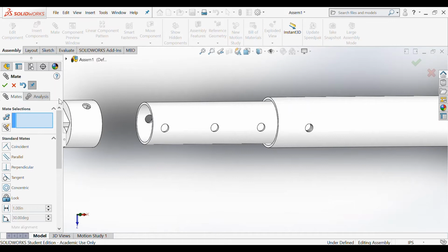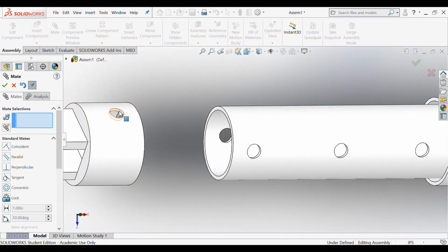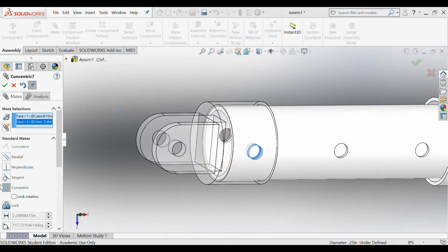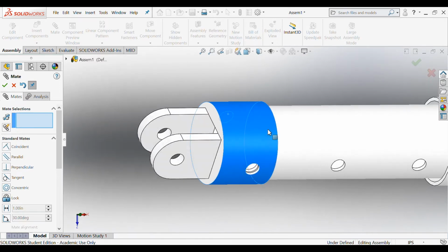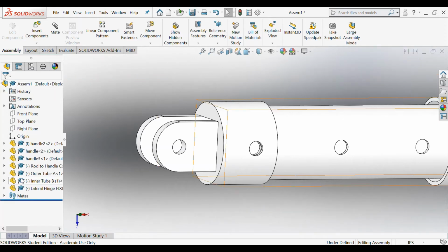And then I'm going to click on the inner hole on the hinge piece and the inner hole of the inner rod, and I'm going to make them concentric as well. Again, you can still rotate it for our 360 motion, which is why these are still going to be underdefined.